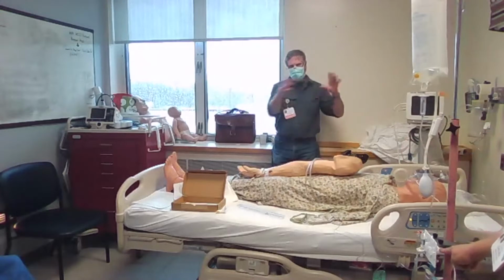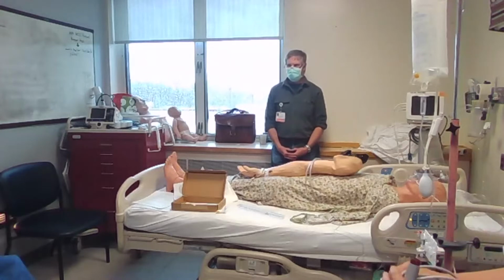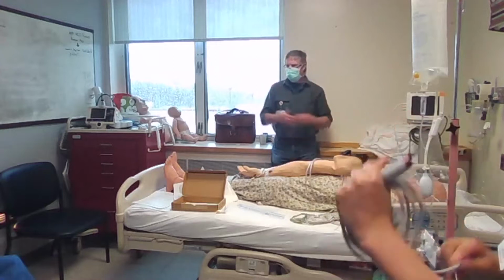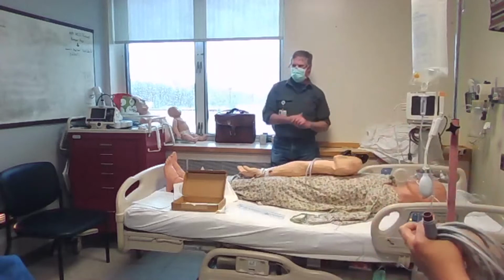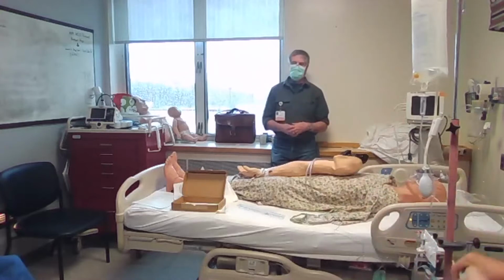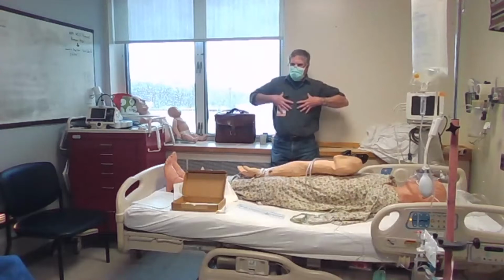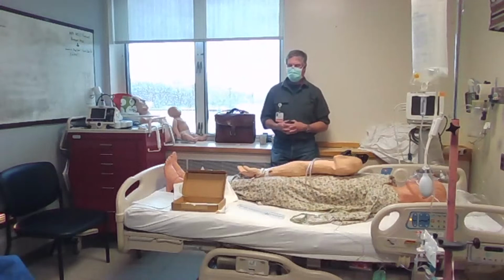Well, it's not a big enough thing that you really need to worry about in a code situation. You would actually have to change like 1 atmospheric pressure with the patient to change internal. It changes a little bit, because they're going to feel less pressure on their body, but it's going to be much less noticeable. In the operating room, when we're really keeping strict control of blood pressures, we'll zero it every time the patient moves, and we'll move everything with it. But in a real life situation, is it really going to matter? Patient goes up, they get a little bit less pressure on their body, but their heart's still making a pressure. It's contained within the body, so it doesn't really get changed all that much for you to really care.